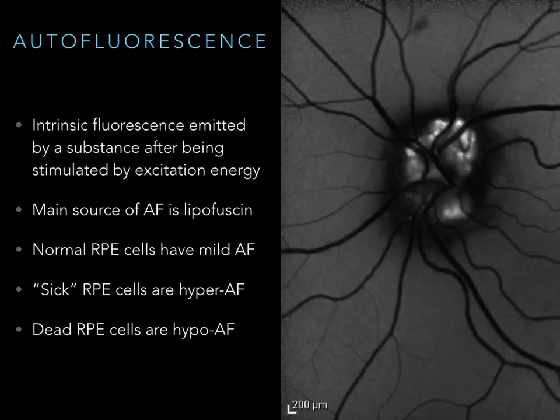All right, so autofluorescence. We talked about sodium fluorescein fluorescing, right? We talked about the atom and the light photon coming in, electron goes up, the different photon comes out. Autofluorescence is that exact same process, but without sodium fluorescein. You could say sodium fluorescein by itself is autofluorescent. It's autofluorescent to itself. It's kind of confusing. But just think of autofluorescence as basically looking at a fluorescein angiogram, but with no fluorescein.